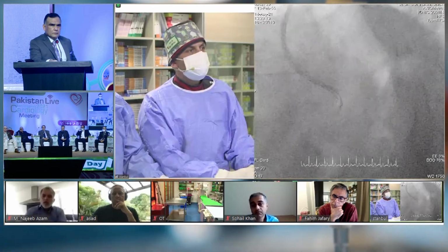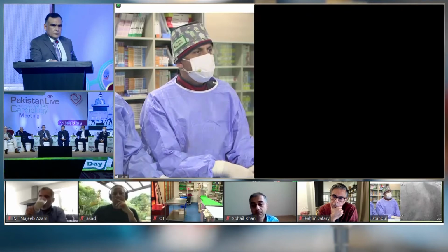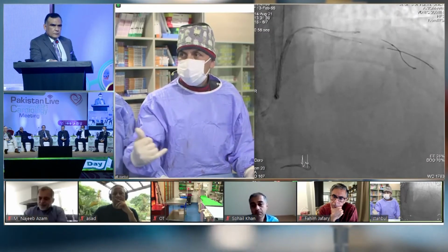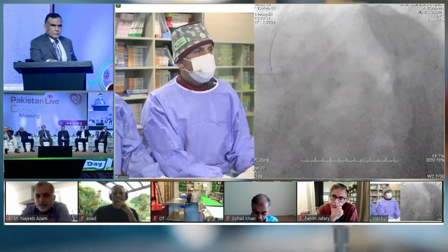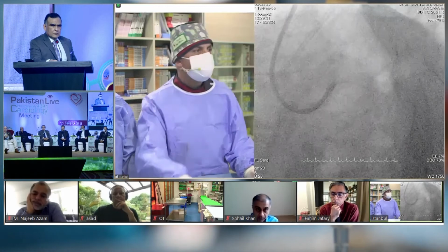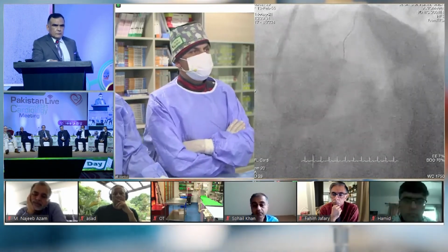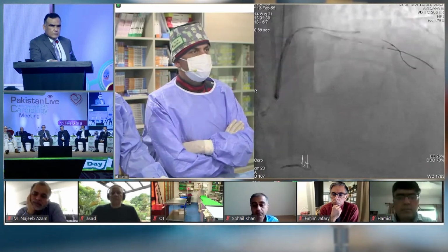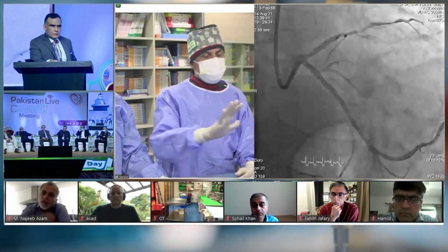So we tried to do it, but we failed. What we did was push the guiding to have direction to the LAD, and now of course we need to cross the diagonal. Next, please. Now, yes, we are here.